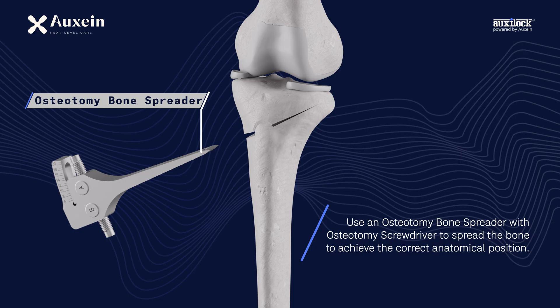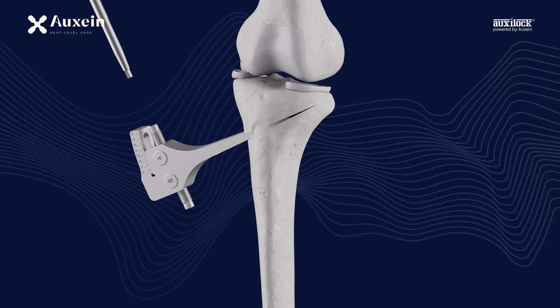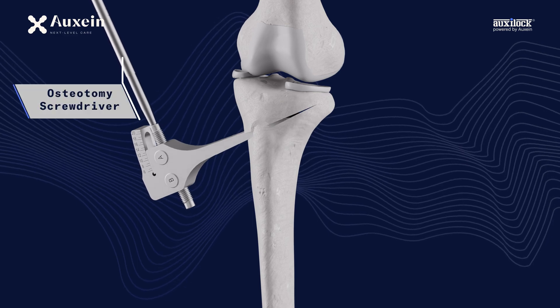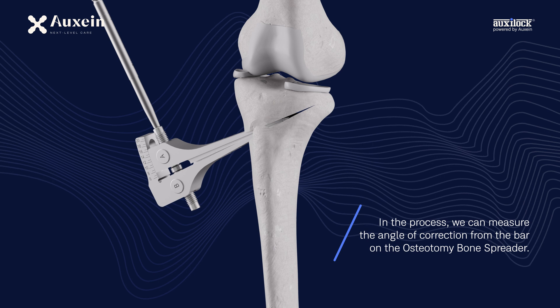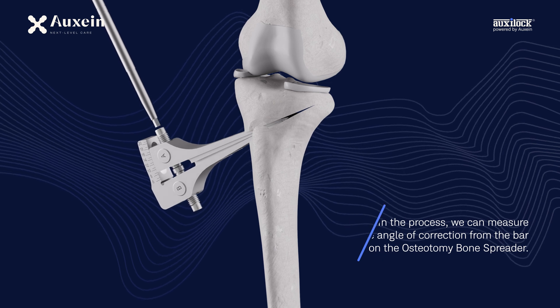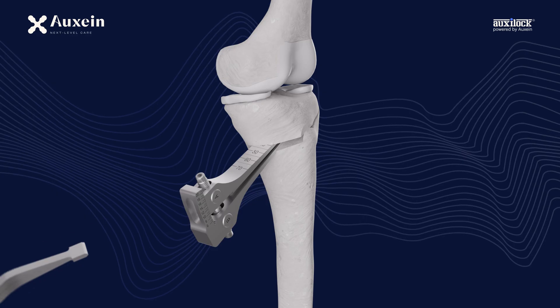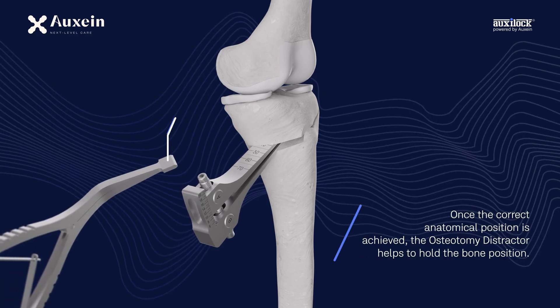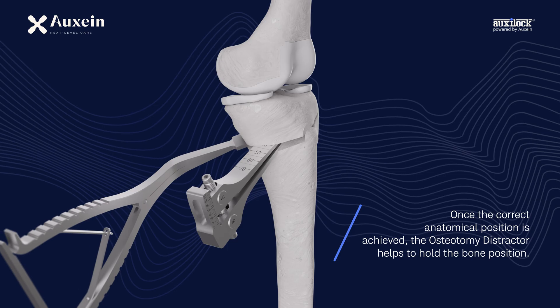Use an osteotomy bone spreader with osteotomy screwdriver to spread the bone to achieve the correct anatomical position. The angle of correction can be measured from the bar on the osteotomy bone spreader. Once the correct anatomical position is achieved, the osteotomy distractor helps to hold the bone position.